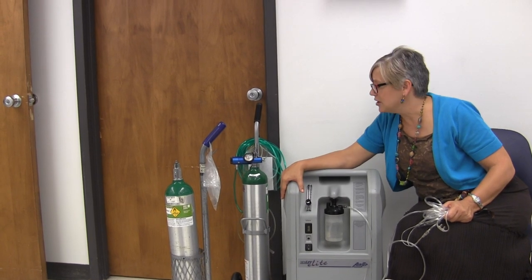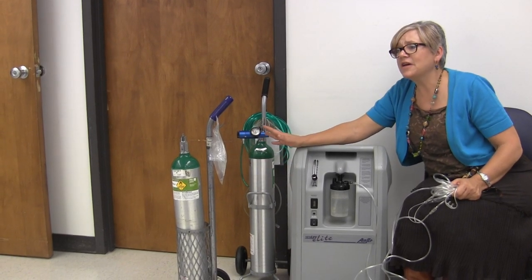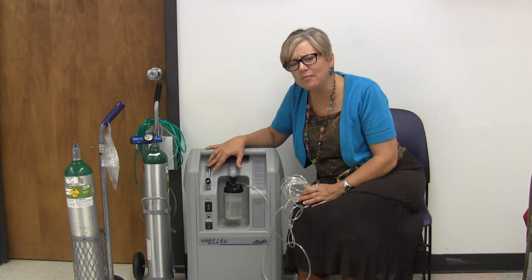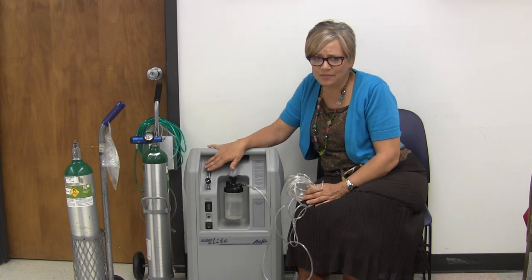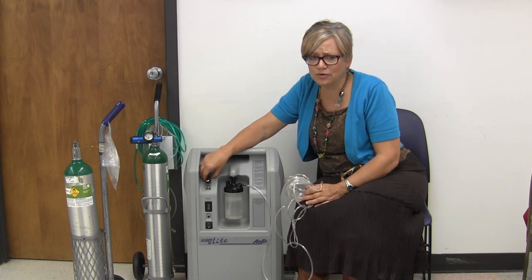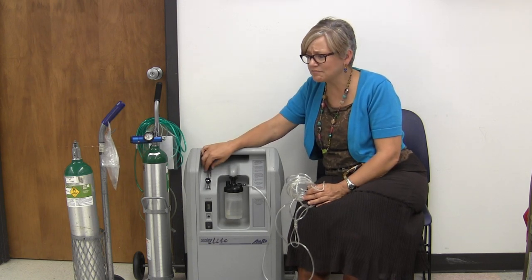Think of oxygen as a drug. You cannot change the flow rate — it's very dangerous. Did you know that if someone has COPD, CHF, emphysema, they may be breathing off their carbon dioxide? And if you turn that oxygen up way too high, you might actually eliminate their drive to breathe. It's best not to mess with that. Never, never change a flow rate from what is ordered without a doctor's order. Your nurse would have to clear that for you. That's not for us to do as aides.